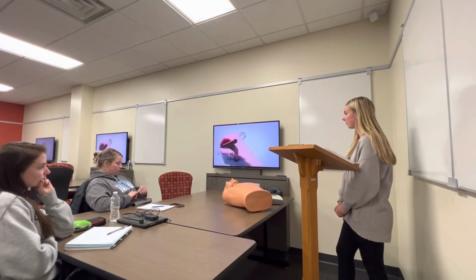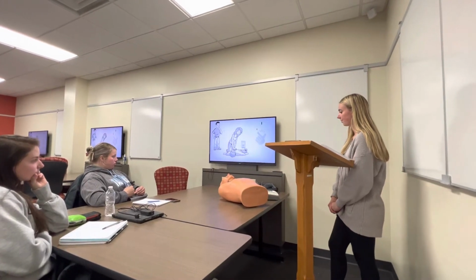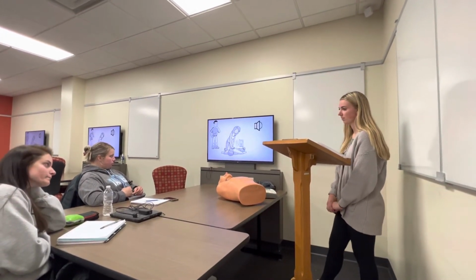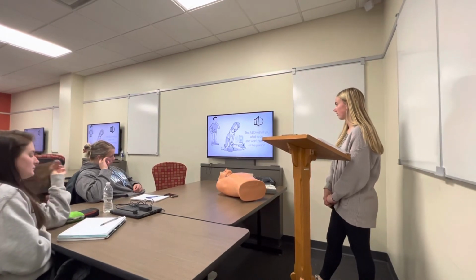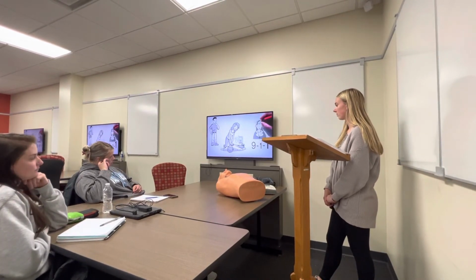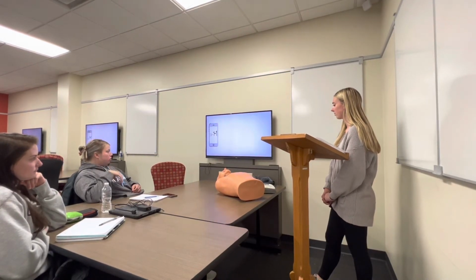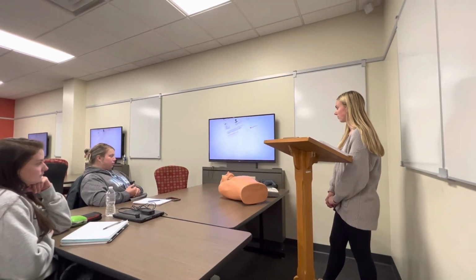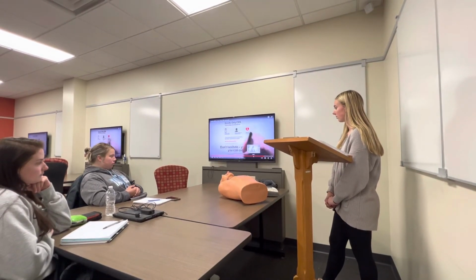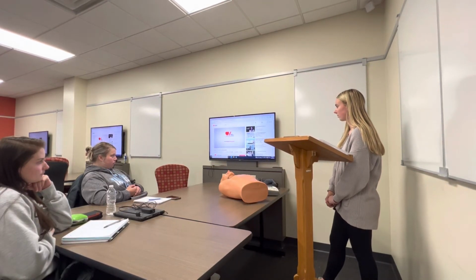If someone brings you an AED, use it as soon as possible. It's easy. Turn it on and follow the voice prompts. Don't worry, the AED will tell you what to do and won't hurt you or the person. The 911 dispatcher can coach you through all of the steps. You can save someone's life using your phone, your hands, and an AED. Don't hesitate. You can't hurt. You can only help. heartandstroke.ca/CPR.